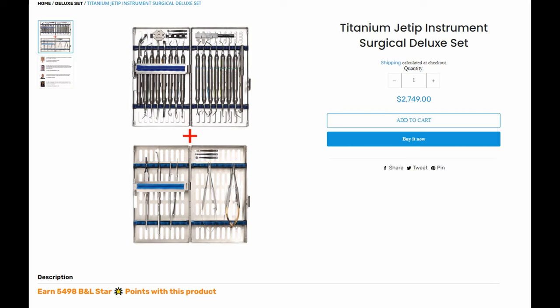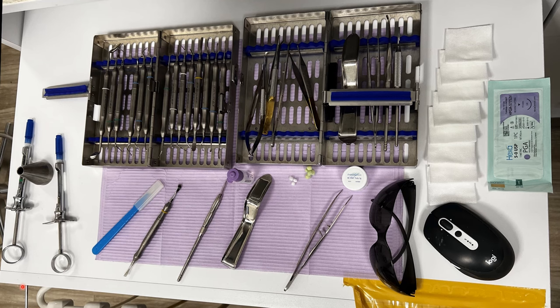This is the kit that I use — it's from B&L. I got the titanium one because it's lighter, so it's easier on your hand. It is pricey unfortunately, but it works fantastic. It has sutures, retro mirrors, and you can add in extra items as well. You do not have to keep to just this kit — you can customize it to be exactly what you want.